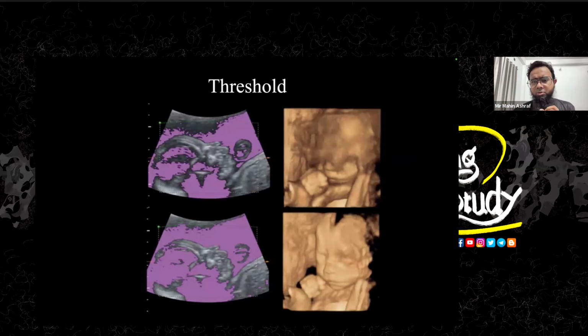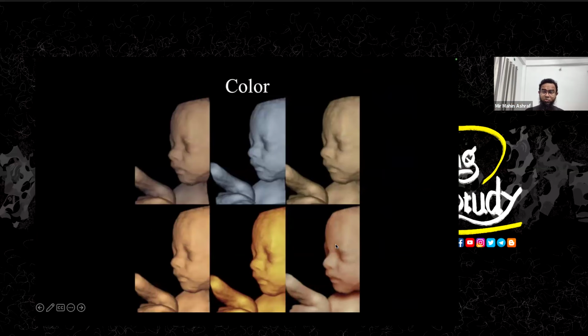I frequently use this option to change the density of the picture. So this is an increased threshold, so you can't see the fetal face quite well. So decrease a little and you can see the picture quite good.